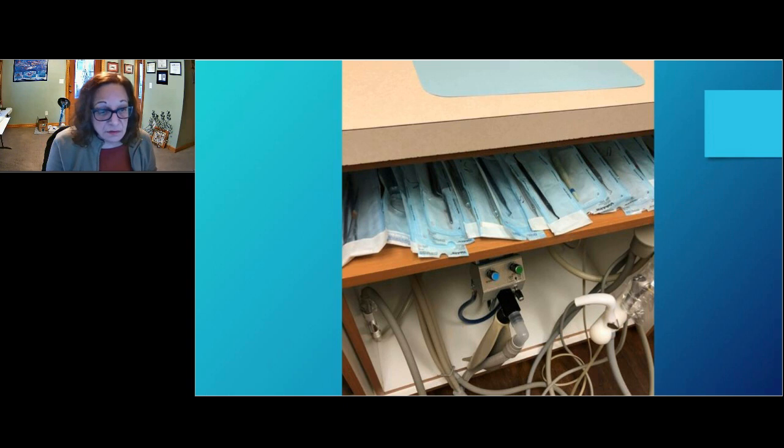My feeling about that is I wouldn't want those instruments used on me, because I would not be assured of their sterility after they sat there for who knows how long, through how many patient uses, procedures, or visits. What this practice needed was to either find a way to close this off or install overhead cabinets, so they could actually have something enclosed to put these sterile items in.